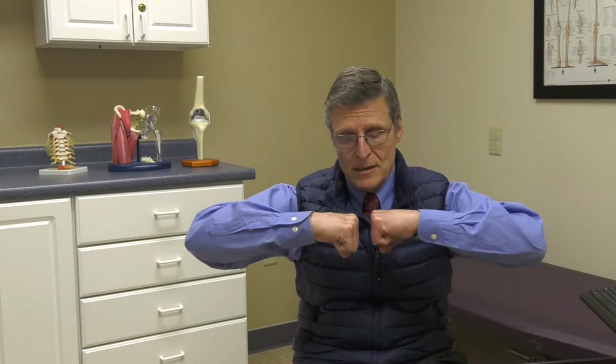And so doing this optimized approach using the computer, we can make adjustments based on the individual patient's anatomy, the patient's soft tissue, their soft tissue balance, so that we can create that balanced extension and flexion gap, both medially and laterally, so that they're all equal in dimension.